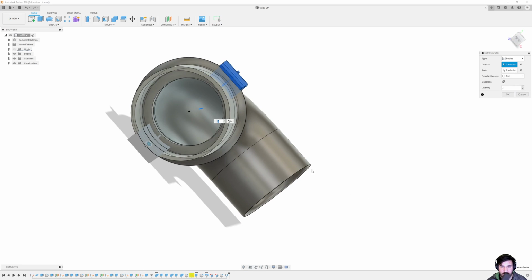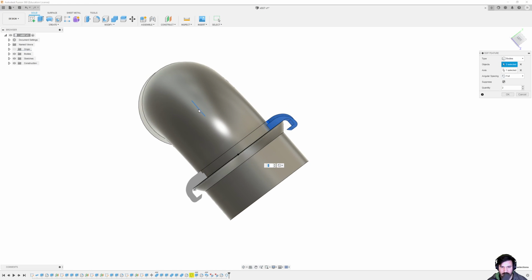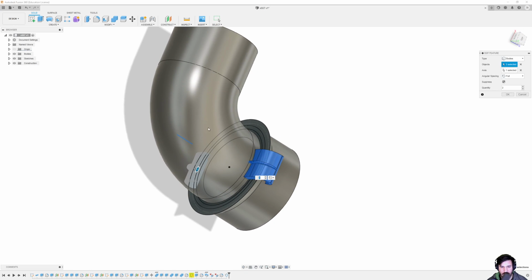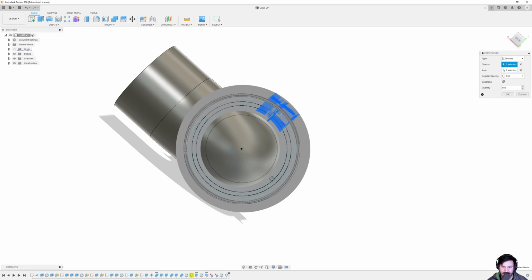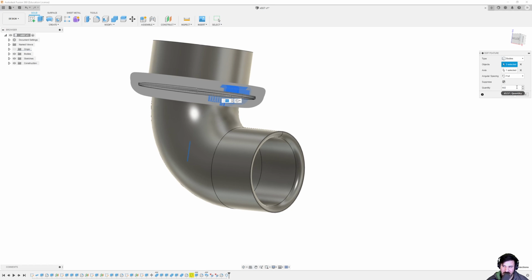It just reflects along this blue axis in there. You can see the line, which is one of our 3 initial axes. So I know it's always centered on this piece, which is the center of the pipe. And so it just goes. If I tell it to do 502 of them, it'll crash the program. And yeah, that's really all there is to it. That's how it looks at the end of the day.